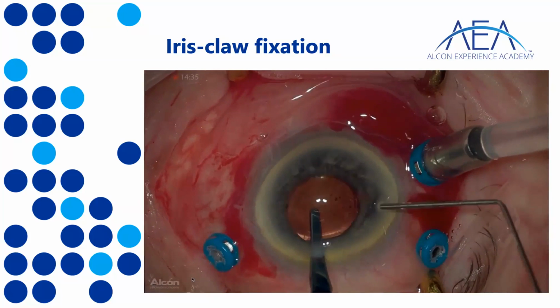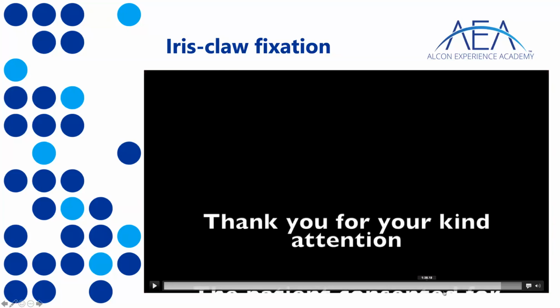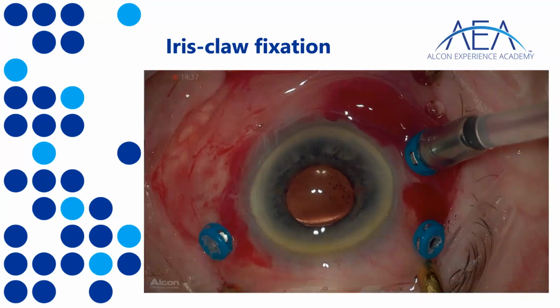You see, the lens sits beautifully in the center. Now, there is one thing, it's not bragging, but what's important here is this number up here. Now, this video may have been short, it's just a minute or so, but this was the time of the operation. This operation took 15 minutes start to finish, all right? It doesn't particularly matter whether you are quick or slow, but what's important is that if you work in whichever environment, you want to maximize the time that you have available and do as many operations as you like.